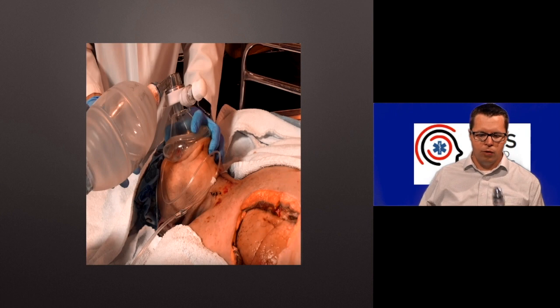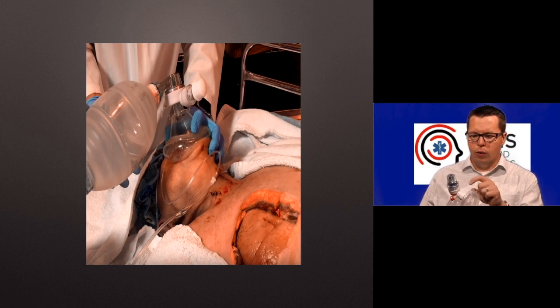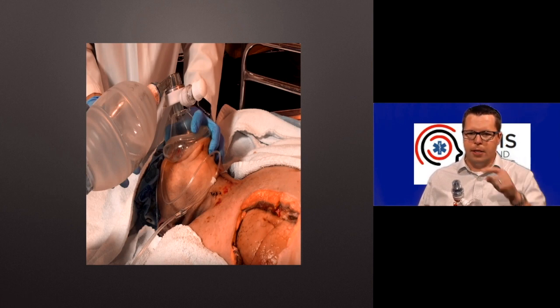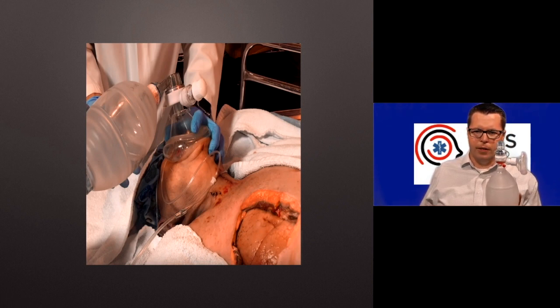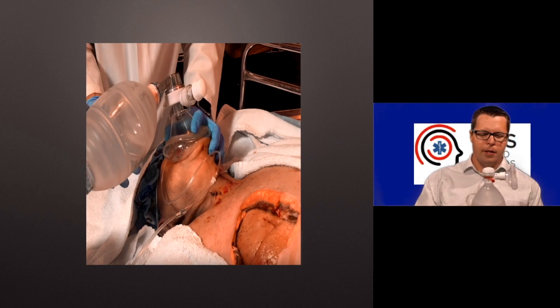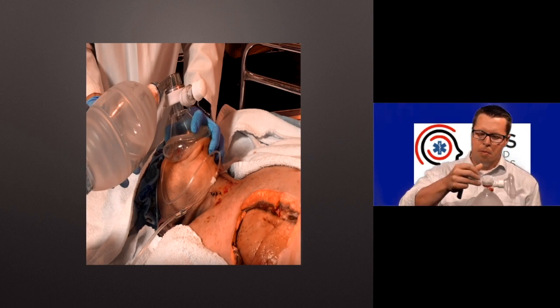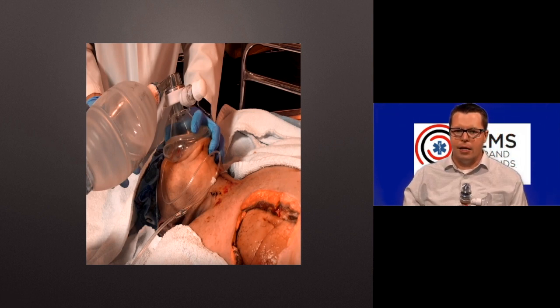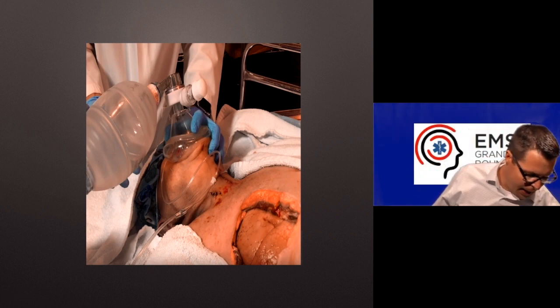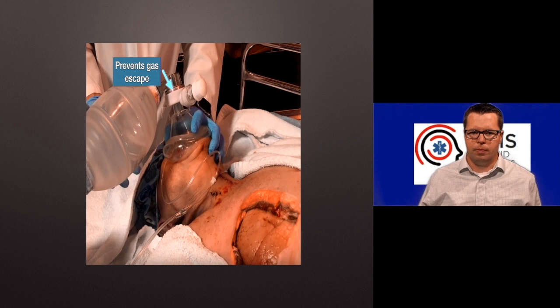If you're delivering a pressure of 10, if you're delivering a pressure of 8 or 5, or whatever it is that you're going to do, even having a bunch of flowing oxygen here will just preferentially flow out the top of this thing if you are using a PEEP valve on the end of it. If you don't have a PEEP valve on the end of it, then it's just 100% FiO2, and it just blows out through the top of that thing for the most part. Put a PEEP valve on it, and when the patient tries to exhale, it will maintain that CPAP, at least some degree of it. And again, it's not quite 10 if you set it to 10, but it's close enough for government work. It gives you something.